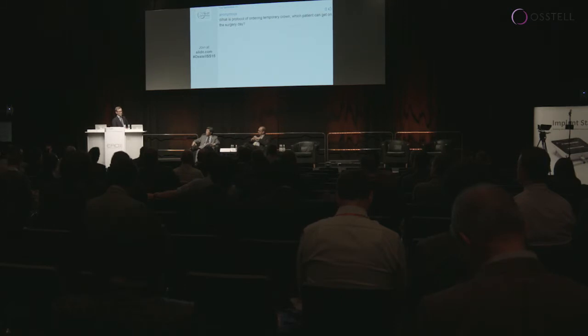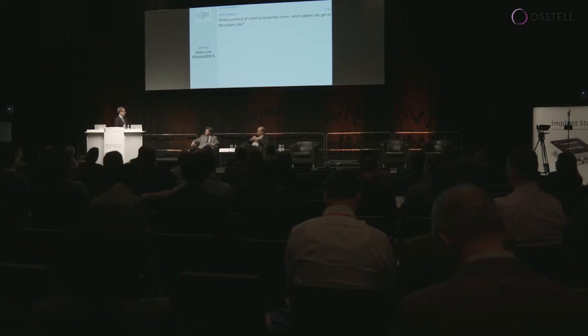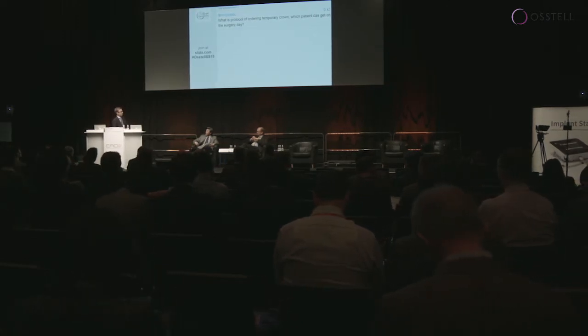and do a screw-retained or cemented restoration. I would also like to touch upon that, because you mentioned in one of the cases, in terms of cementing the temporary crown or using a screw-retained one, that you prefer screw-retained, is that correct? Yes, that is absolutely correct.